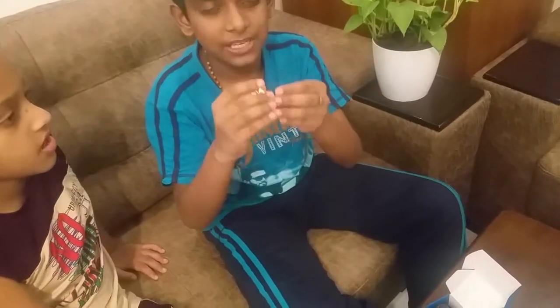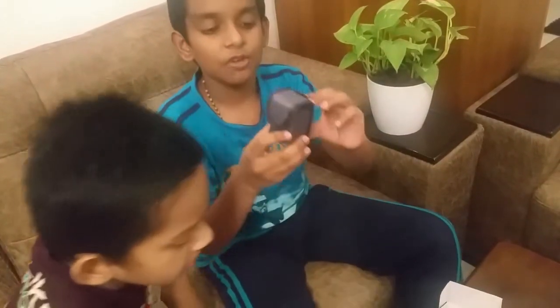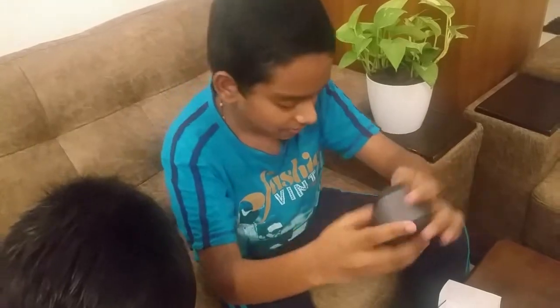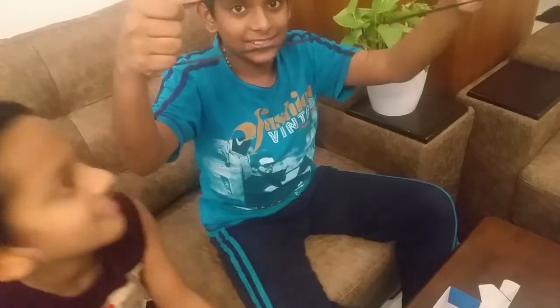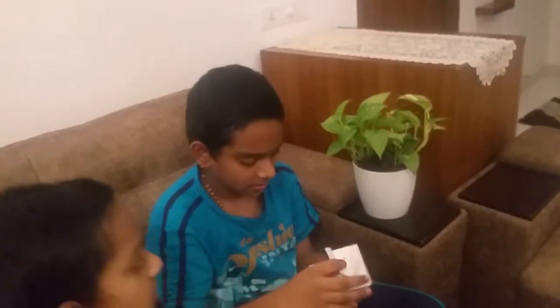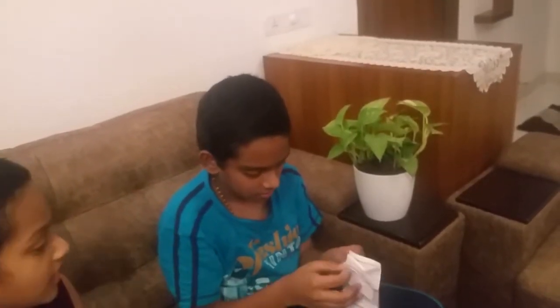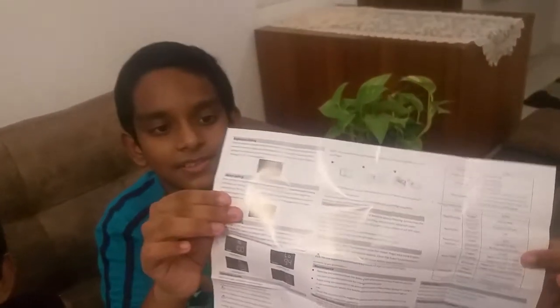So guys, this pulse oximeter works with two AAA batteries and they have included them with it. We also have a pouch along with it — it's actually wonderful so that we can carry it around. And what is this? It's a user manual, guys.